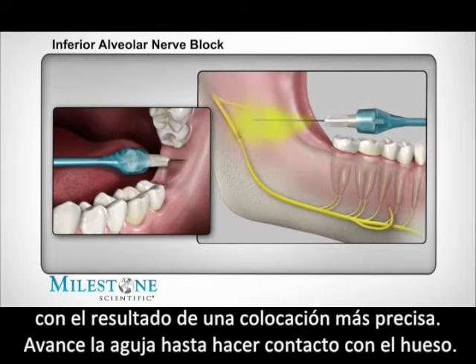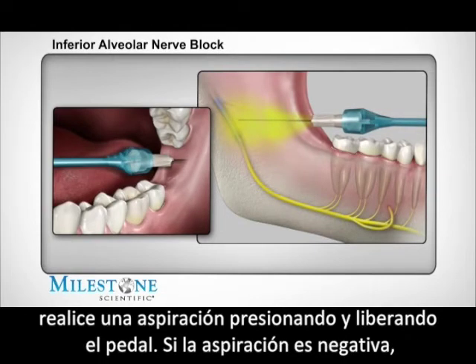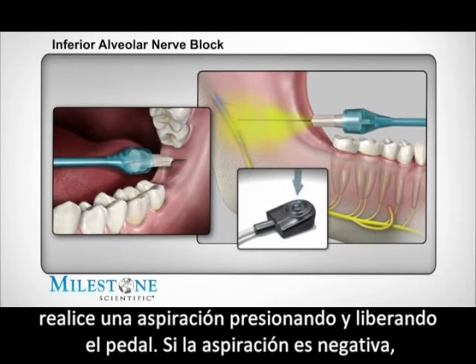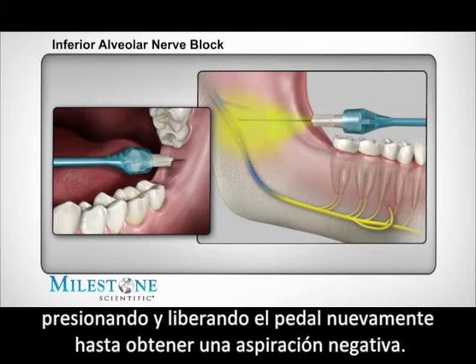Advance the needle until bone is contacted. The final target is the medial aspect of the ramus. Once at your target site, perform an aspiration by depressing and releasing the foot control. If the aspiration is negative, continue the injection. If aspiration is positive, reposition the needle and repeat aspiration by depressing and releasing the foot control pedal again until a negative aspiration is obtained.